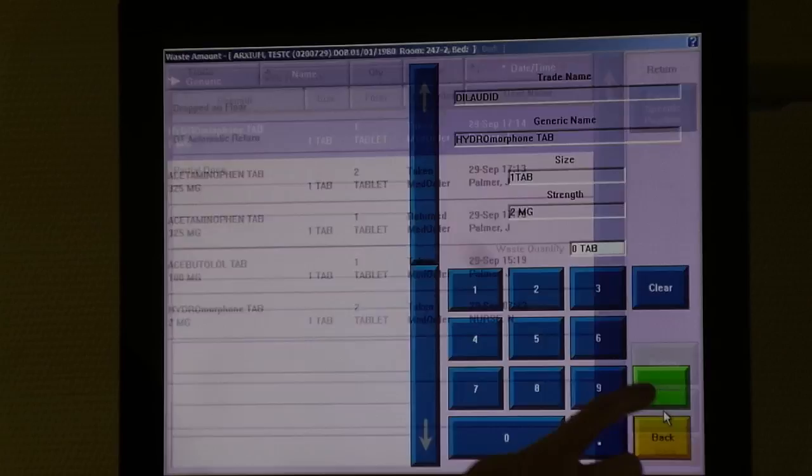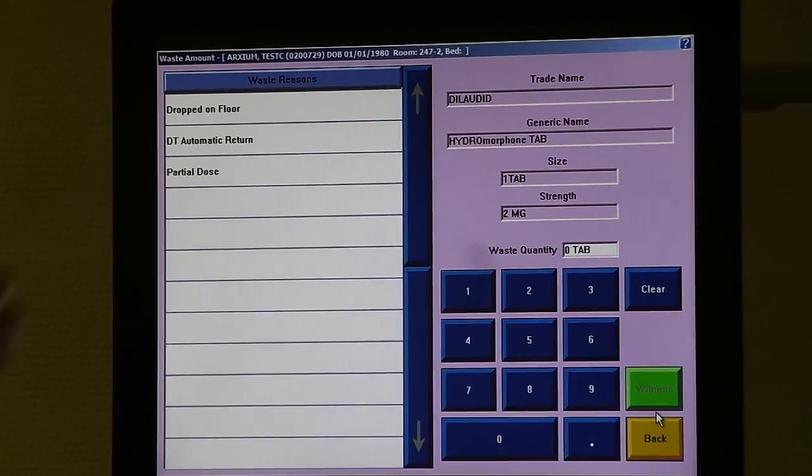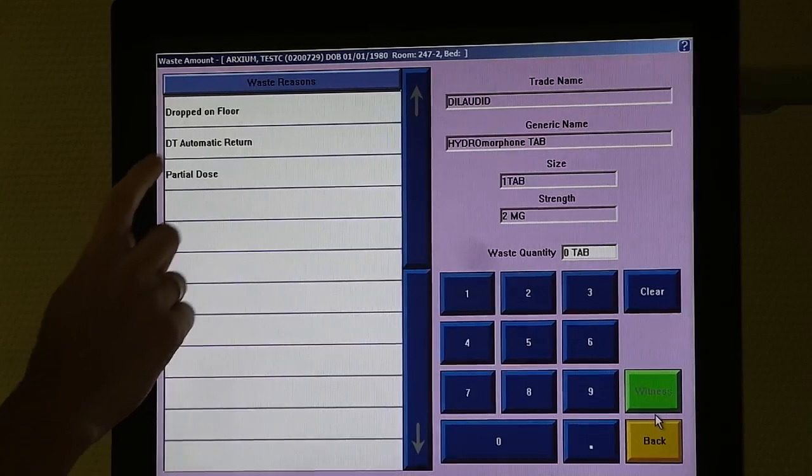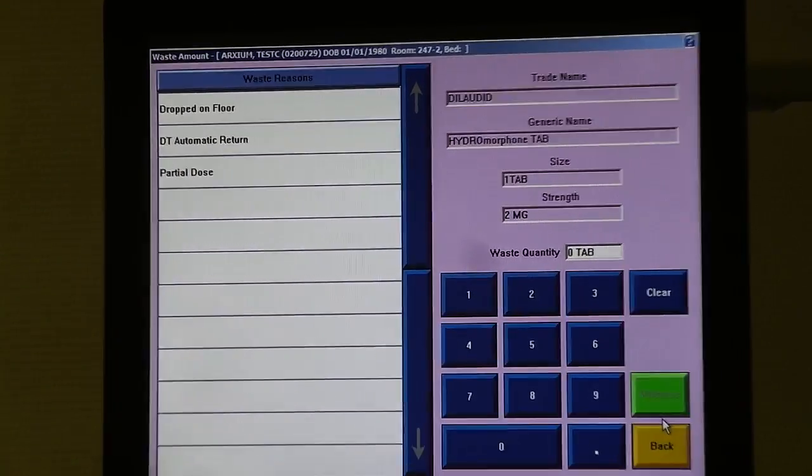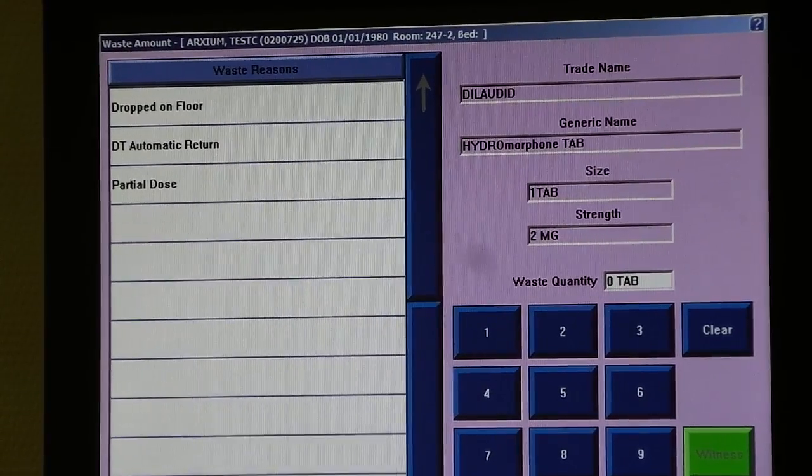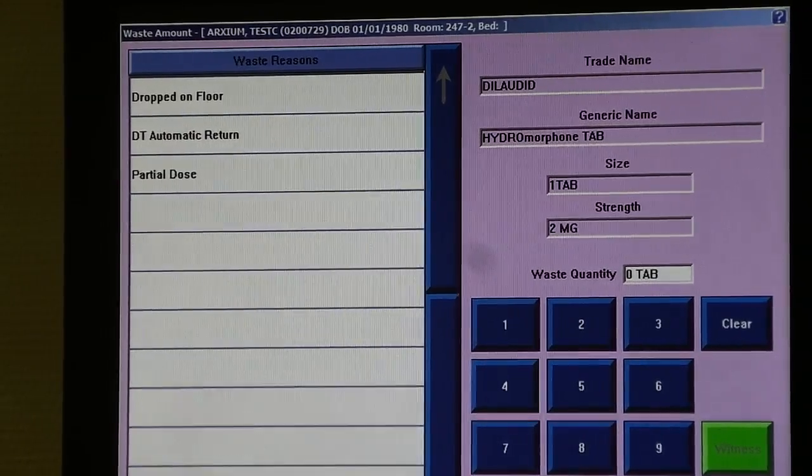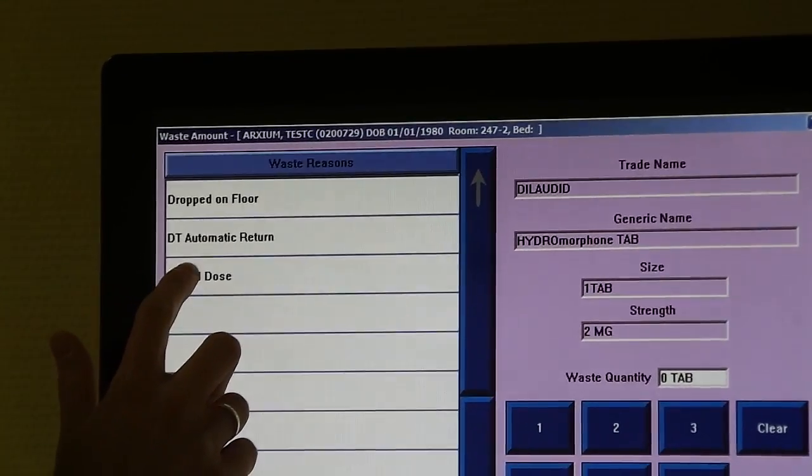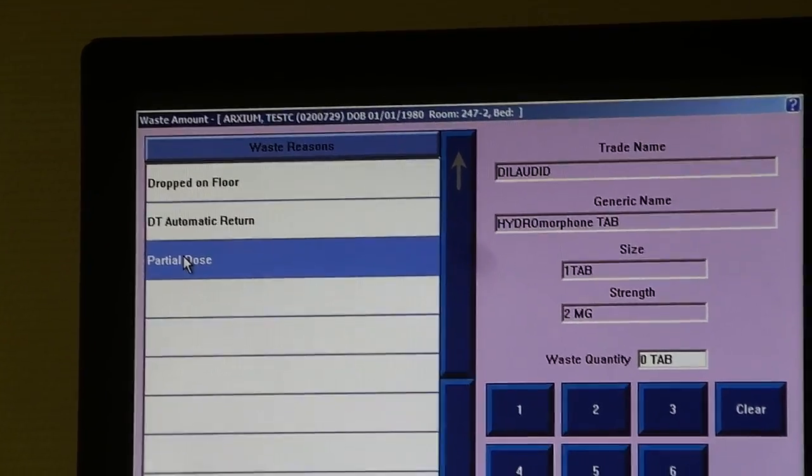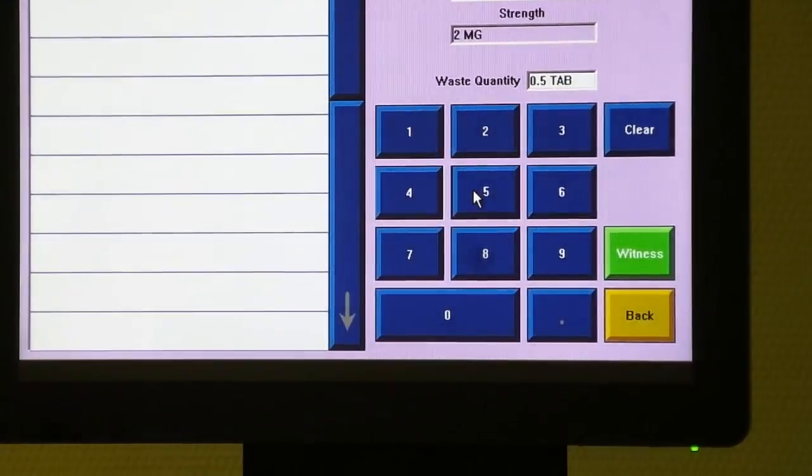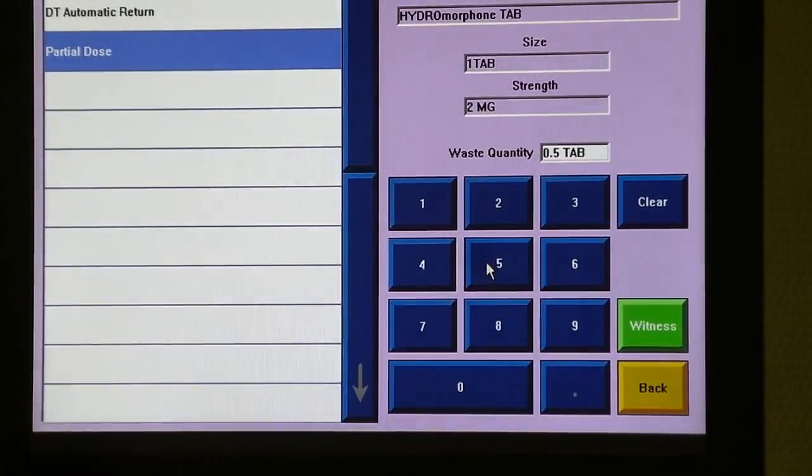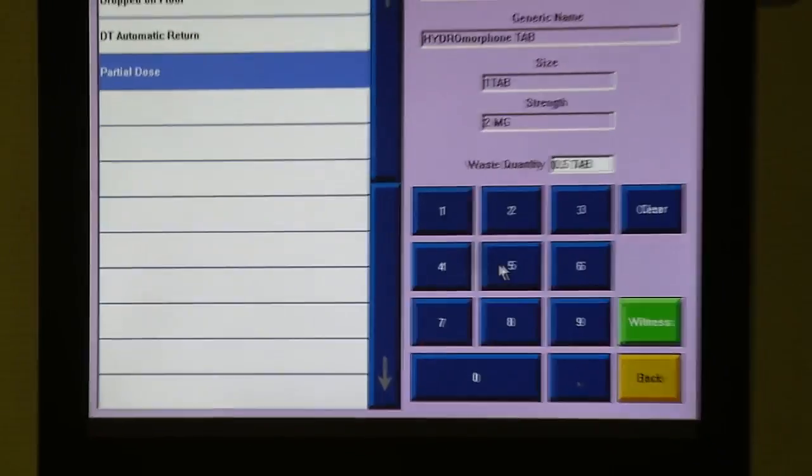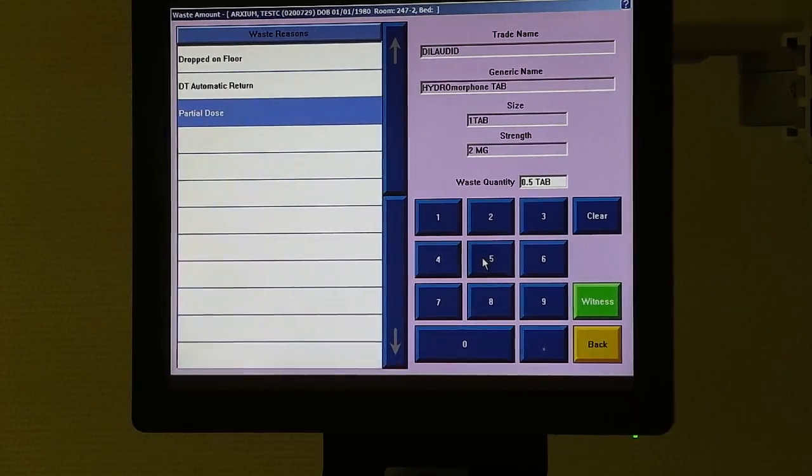Select waste, choose your reason. In this case let's say the dose was only for half a tablet, so our reason would be for partial dose. We would say that we are wasting now half a tablet. And in this case you'll notice that there's a prompt here for witness.